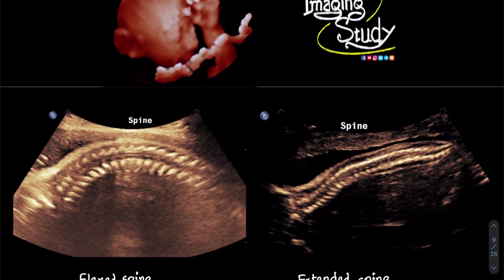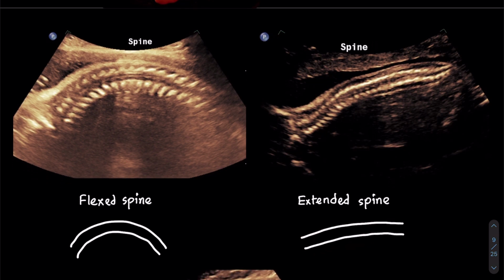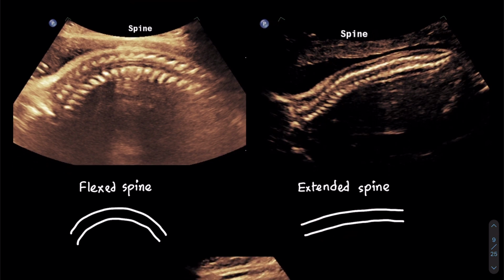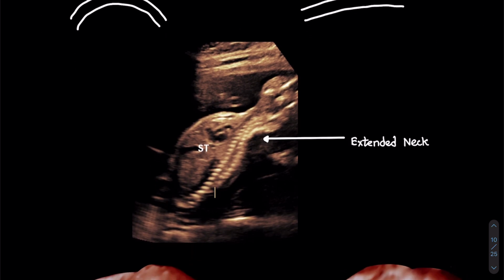Here on the left, you can see a flexed spine with a good convexity. Suddenly, you will see the fetus to move and spine will lose its convexity. It will become quite straight like we can see on the right one. You can also see extension of the fetal neck sometime. While watching this part, you should also try to extend your neck and practice tone on yourself. Trust me, it's a good way to learn.